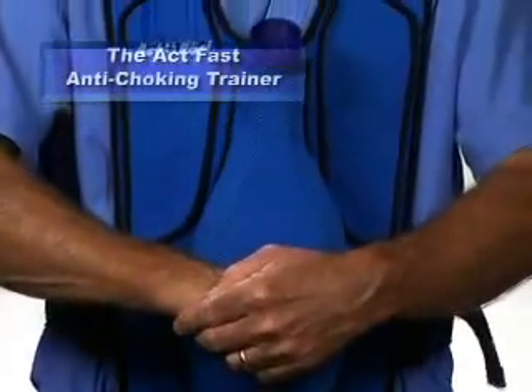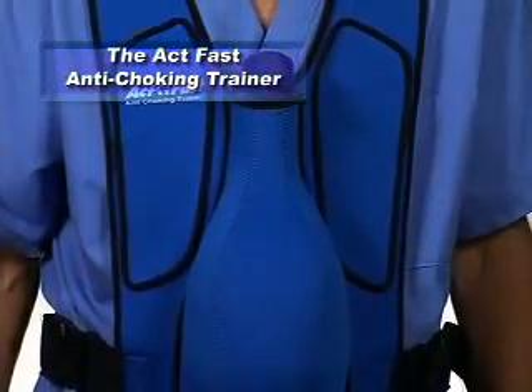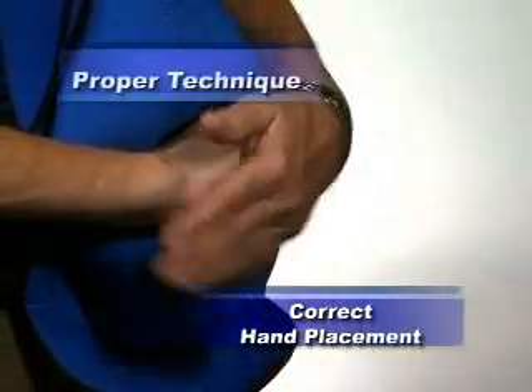The Act Fast Anti-Choking Trainer teaches two important things for the abdominal thrust maneuver: correct hand placement and proper technique.